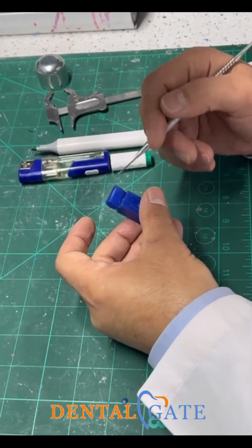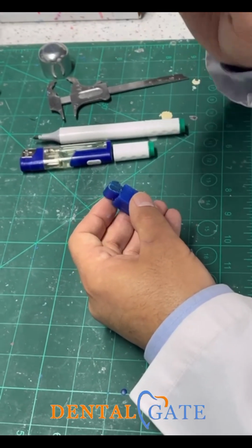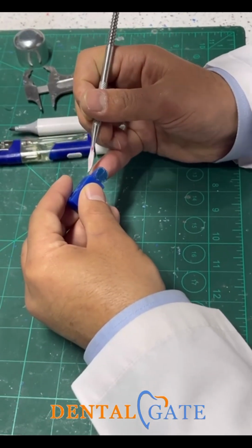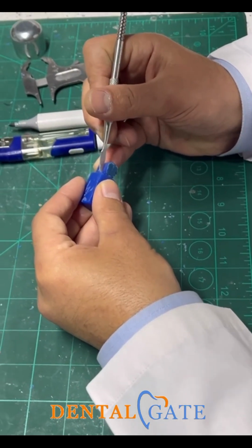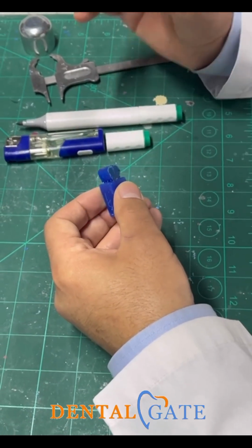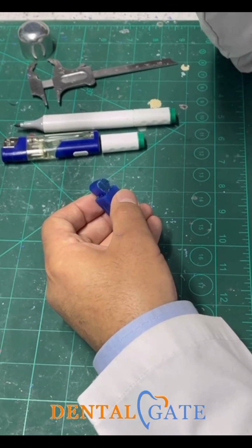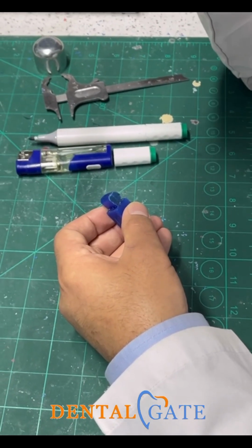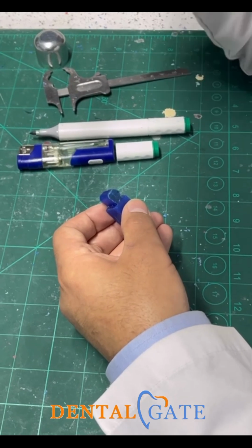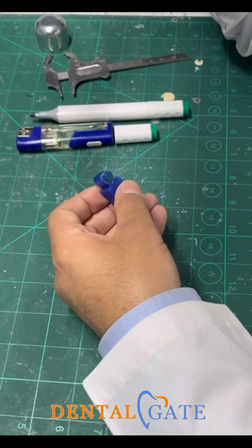Don't start with the distal aspect or mesial aspect. Make sure all measurements are good. Make sure this surface represents one line, one aspect within this outline, okay? So what will we depend upon? As we mentioned in the previous lab, we will depend upon the measurement and the shape. The measurement alone is not complete, I cannot adopt it for the shape. The measurement represents only minimum width and maximum width.